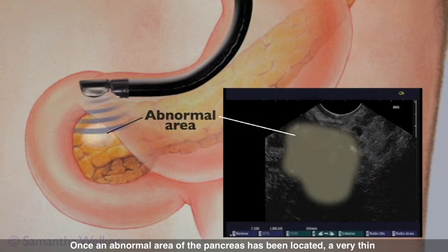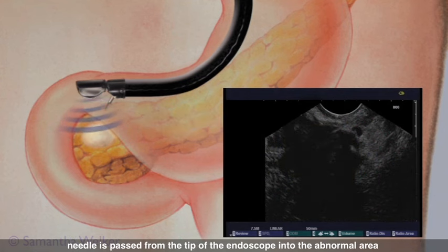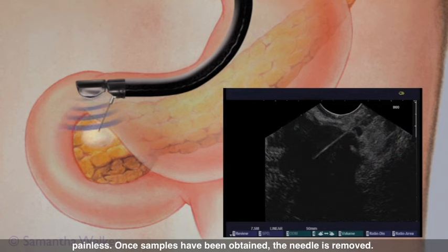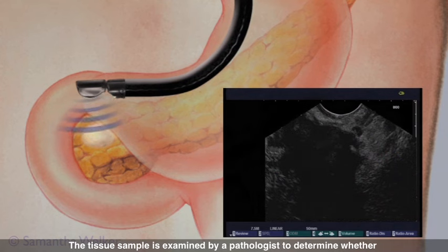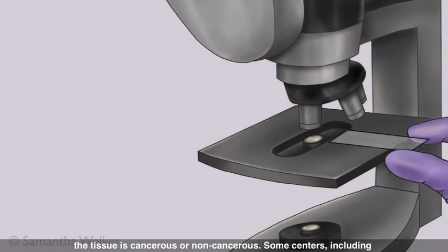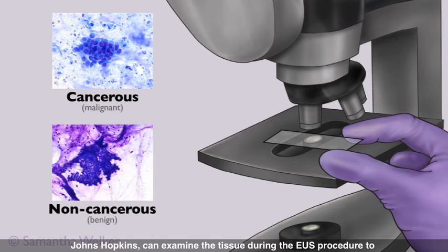Once an abnormal area of the pancreas has been located, a very thin needle is passed from the tip of the endoscope into the abnormal area under continuous ultrasound monitoring. This fine needle biopsy is painless. Once samples have been obtained, the needle is removed. The tissue sample is examined by a pathologist to determine whether the tissue is cancerous or non-cancerous.